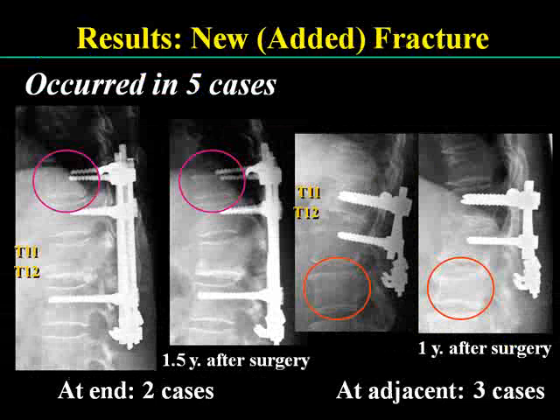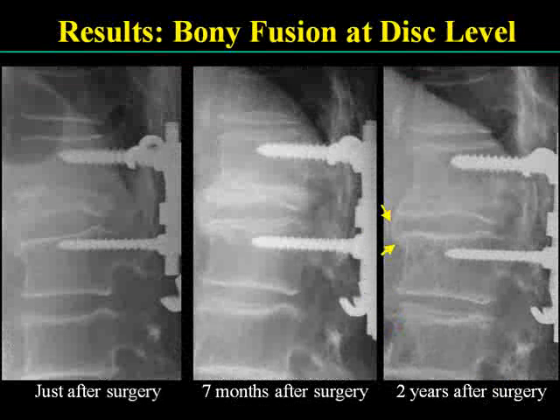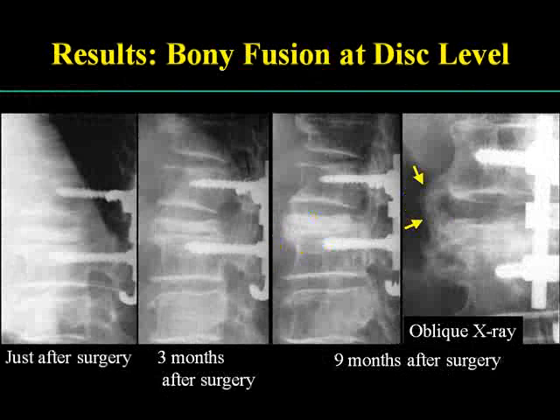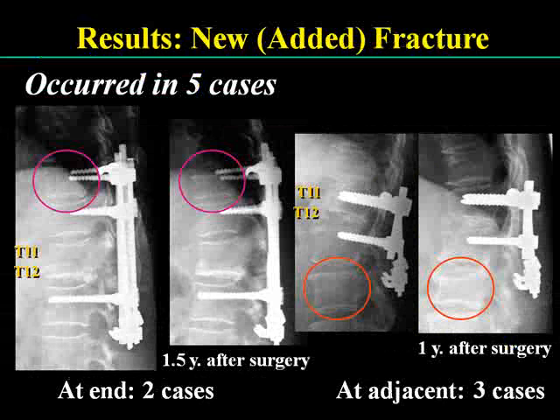New or added fracture occurred in 5 cases after surgery. Fracture occurred at the end of instrumentation in 2 cases, and at the adjacent level in 3 cases. This is a slide showing the bony fusion at disc level. This is a slide showing new added fracture.